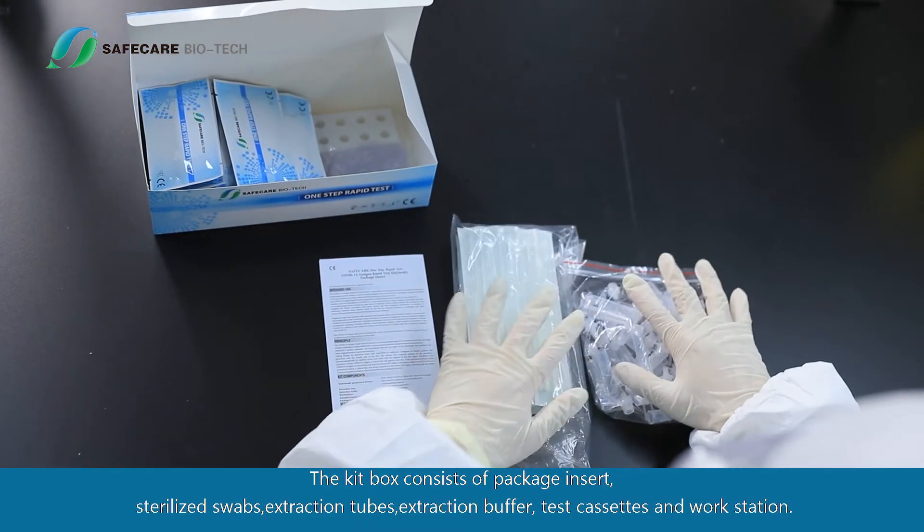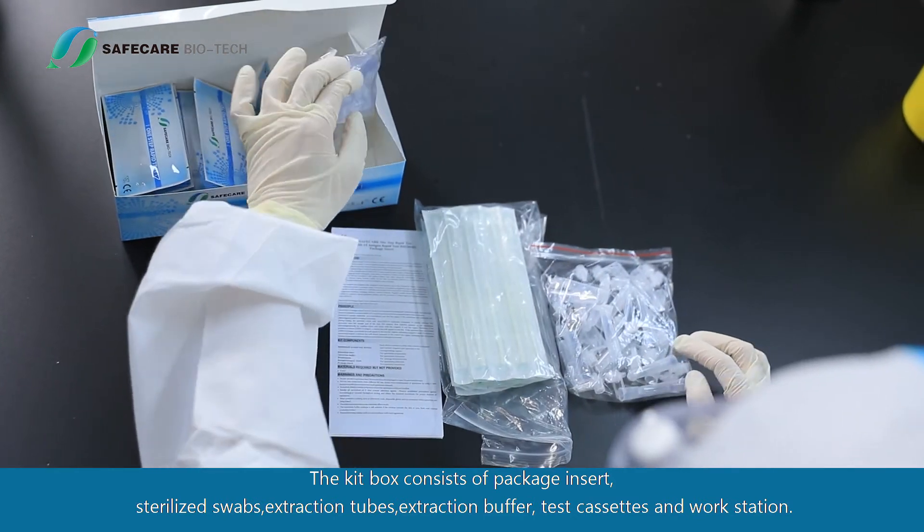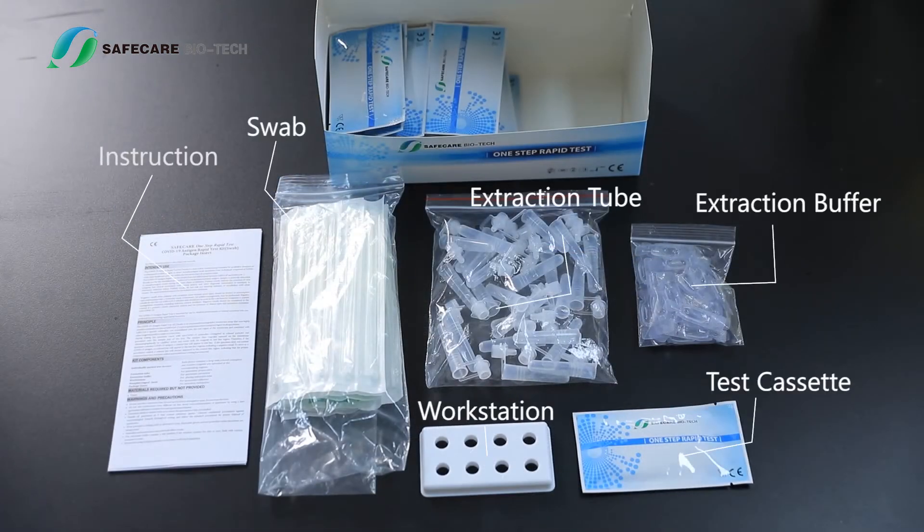The kit box consists of a package insert, sterilized swabs, extraction tubes, extraction buffer, test cassettes, and a workstation.